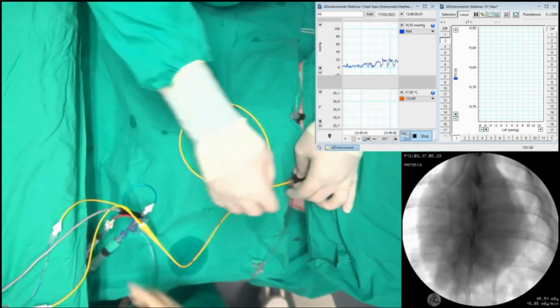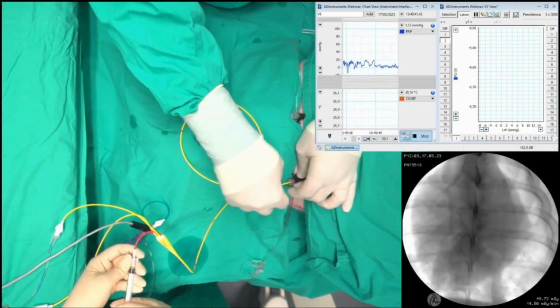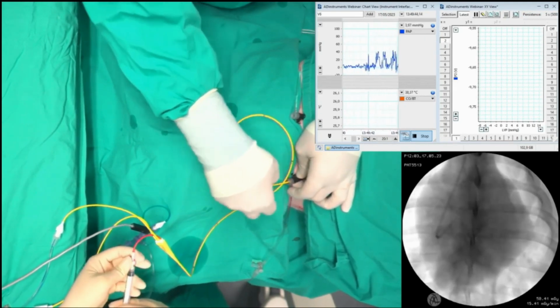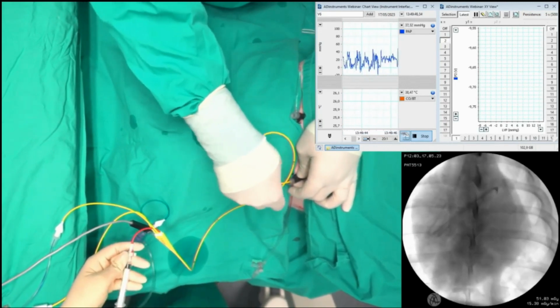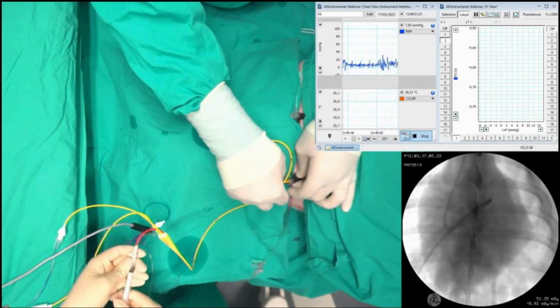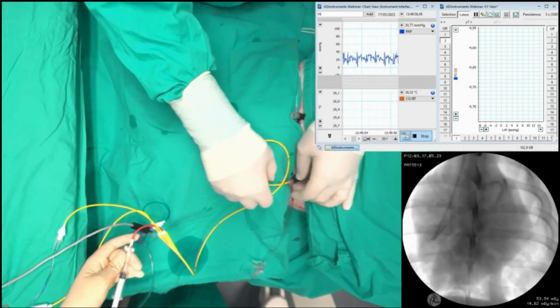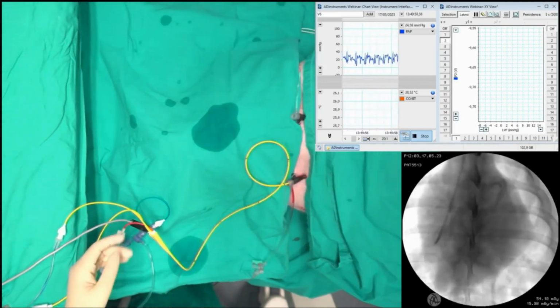Then we inflate the balloon, in this case with 1.5 cc's of air, and you will be able to see the balloon being inflated there. And then we just push the catheter forward, and it will follow the blood flow into the RV, into the pulmonary artery, and then it will get stuck in a wedge position. Once there, you can deflate the balloon, and then pull the Swan-Ganz catheter a little bit back, and you will be in your pulmonary artery or in the main trunk, where you can measure pulmonary artery pressure or record your cardiac output.